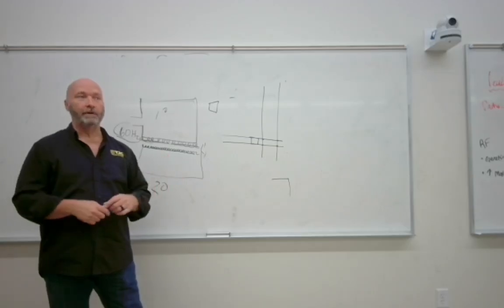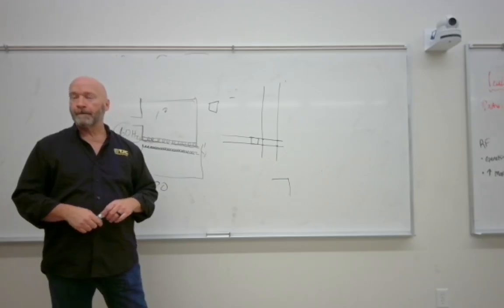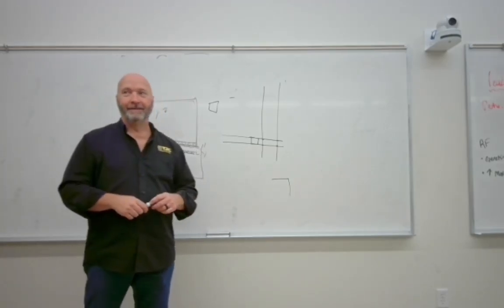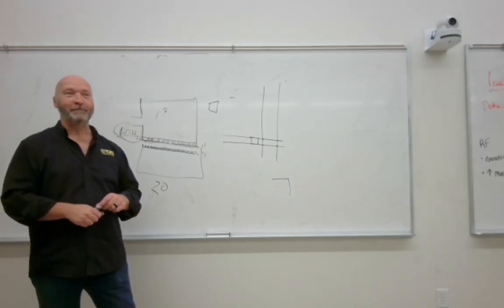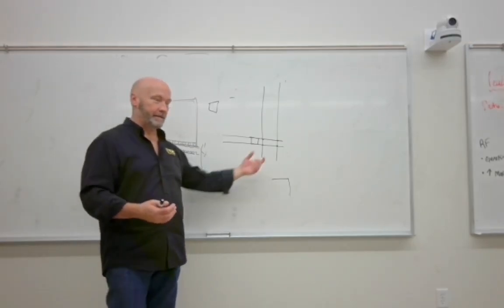So it's pretty strong, but they're activated with solenoids. Same thing with the table. The table's probably not as strong as what these are, because in a lot of your tables, if you lean up against it, anybody done that? Either in clinicals or in lab? Yeah, it'll move out from under you in some cases. So, but it's the same thing.